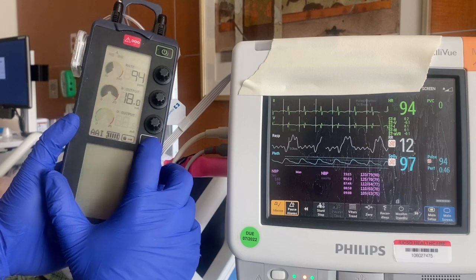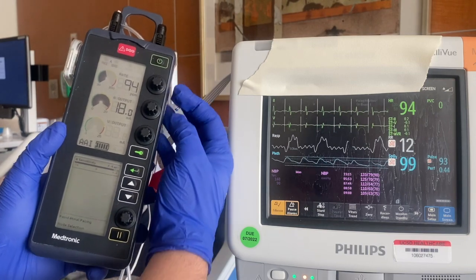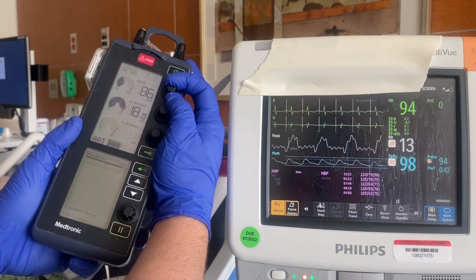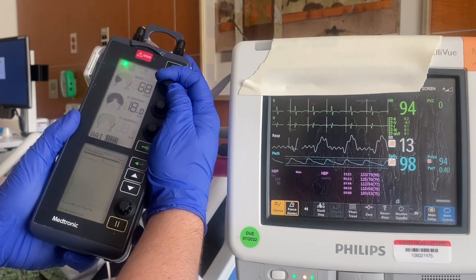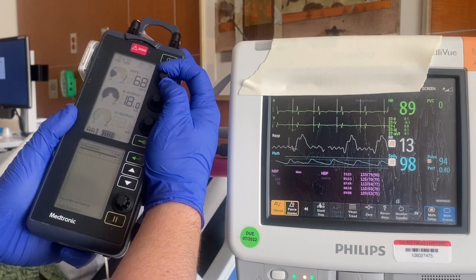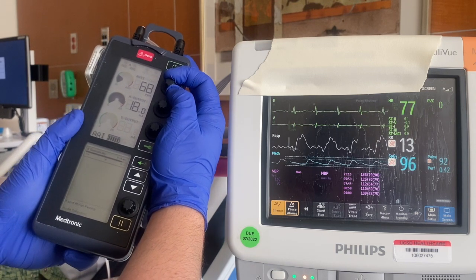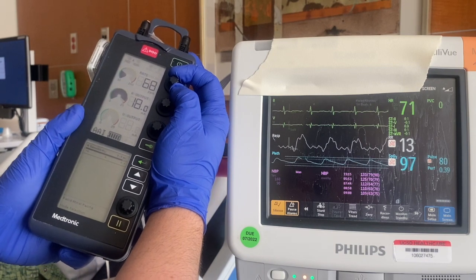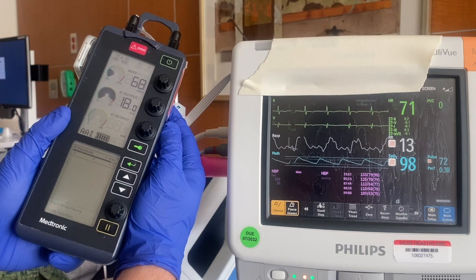First we need to unlock the box — press and hold until the lock disappears. To check the underlying rhythm, you will slowly decrease the pacemaker rate until the underlying rhythm emerges. Watching the monitor, you're looking for a loss of capture and for the pacer spikes to disappear. Here you see that the patient has converted into a sinus rhythm rather than a paced rhythm — that is the patient's underlying rhythm. He's now at a sinus rhythm of 71.